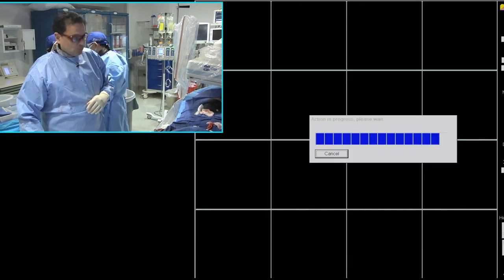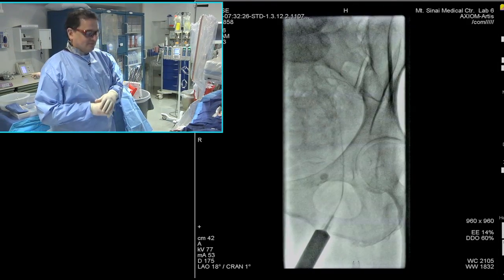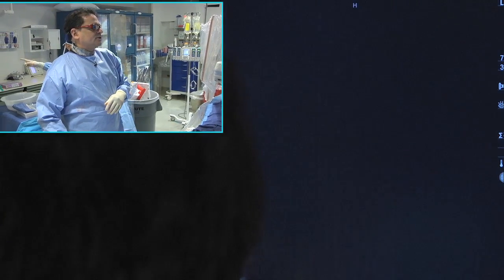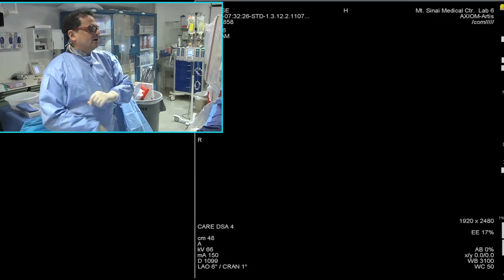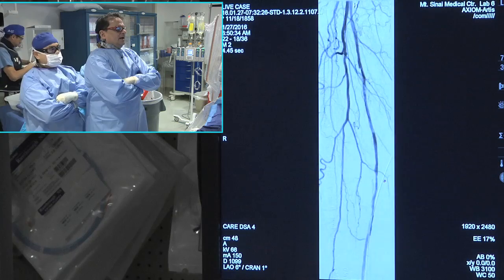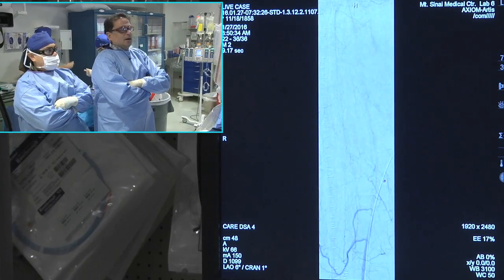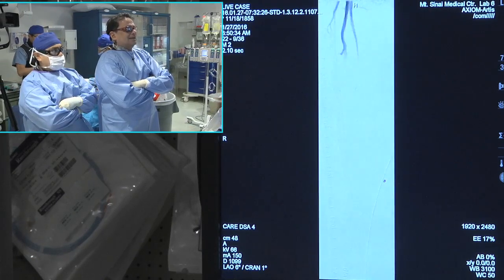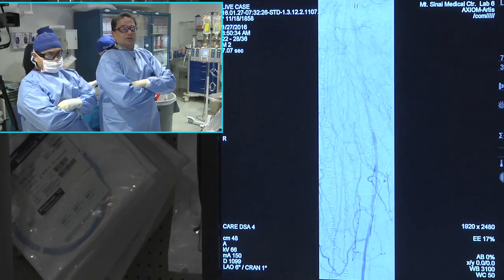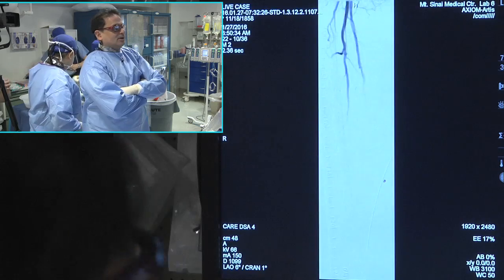As you can see, Elizabeth does a wonderful job of sedating, and that's why our patient is resting comfortably. And I just want to show you the picture, and then we can discuss what our plan is. So you can see our picture here now shows a lesion that's been debulked with areas really of some dissection, but nothing horrible. Exactly. And I think this is a credit to recognizing the thrombus, and also recognizing use of an 014 wire rather than an 035 wire.